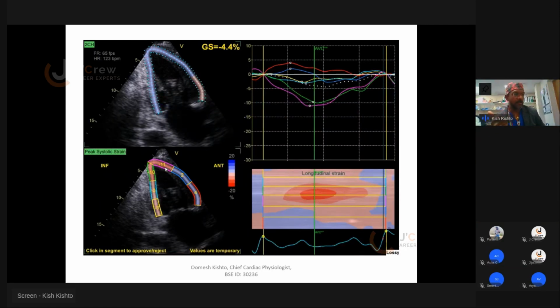and make sure the LV stroke volume, we assess that. Increased ventricular mass, which we have seen, and if there's any pericardial effusion, which we've seen in this image as well, and the valvular thickening, and as we can see, they are quite thickened and calcified, and biatrial dilatation, which is part of the assessment, and the mitral Doppler as well, and the TDI.